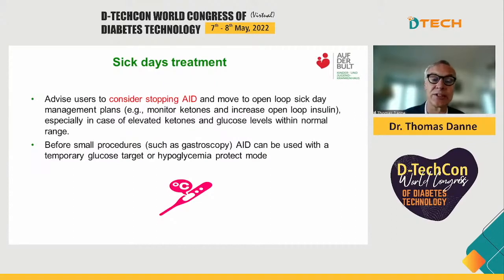Dr. Pradik has already discussed at great length the treatment in the hospital. Again, the pump can be used during small procedures. You can continue using the hybrid closed loop here, maybe in order to reduce the risk of hypoglycemia. Again, use a temporary glucose target, or, for example, the sports mode, to protect against hypoglycemia.